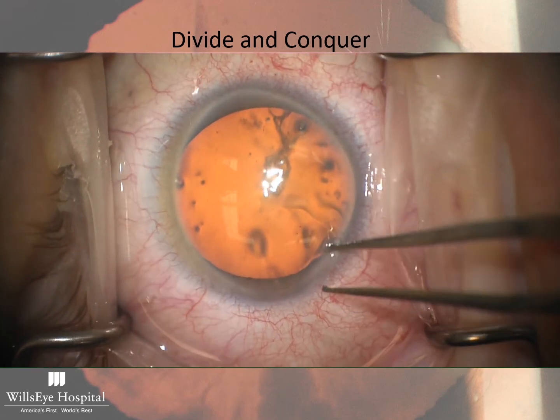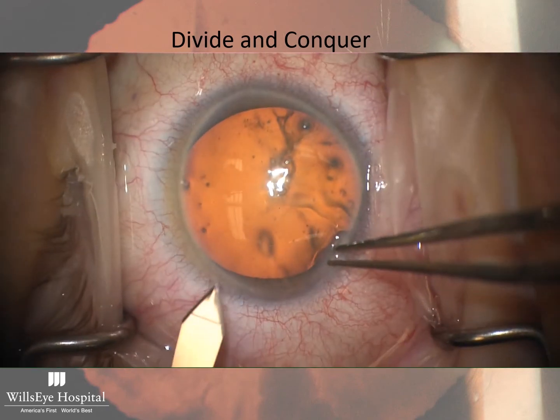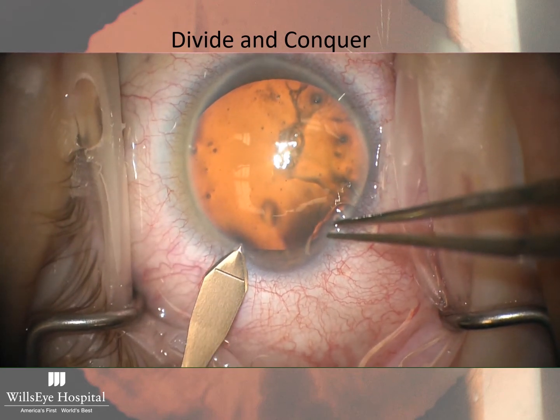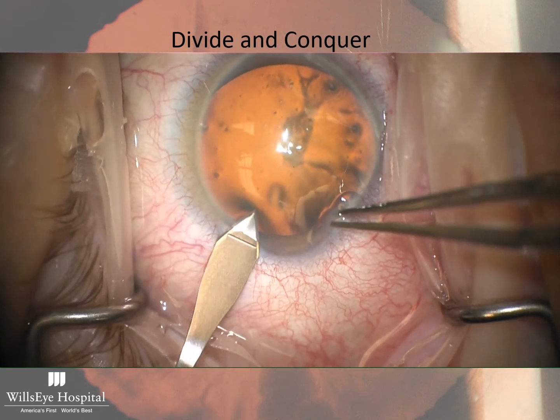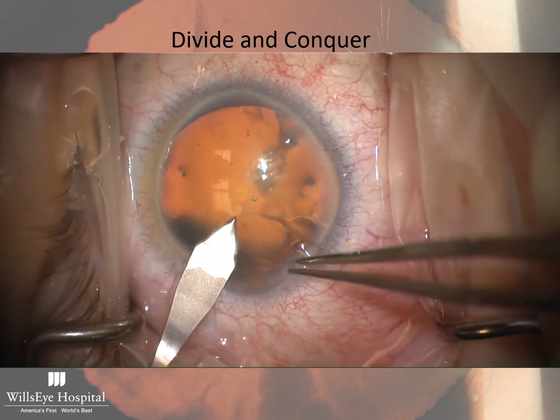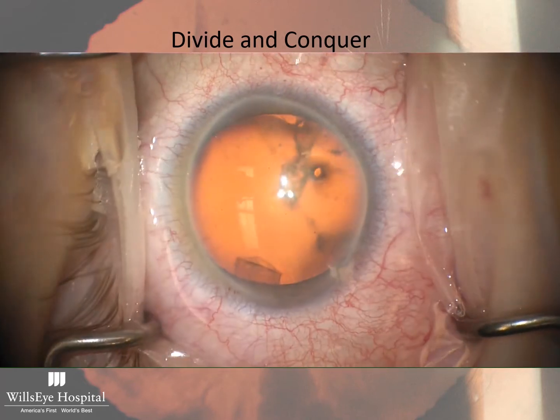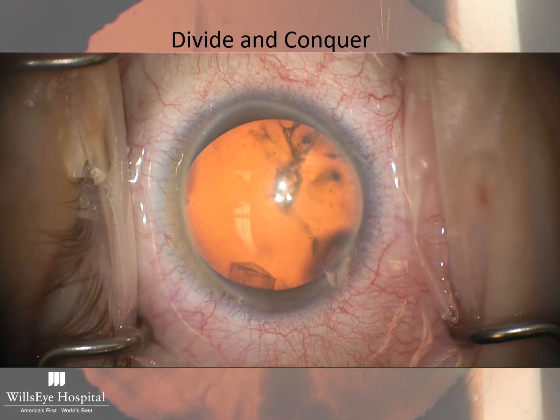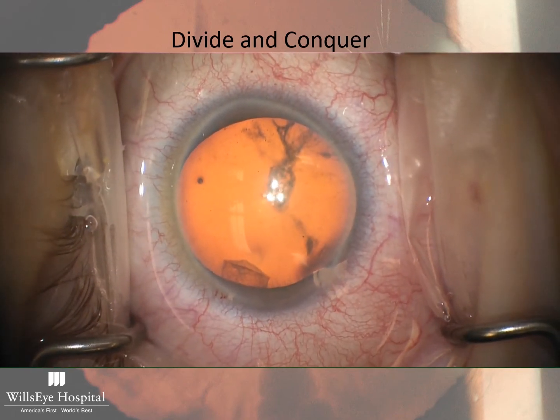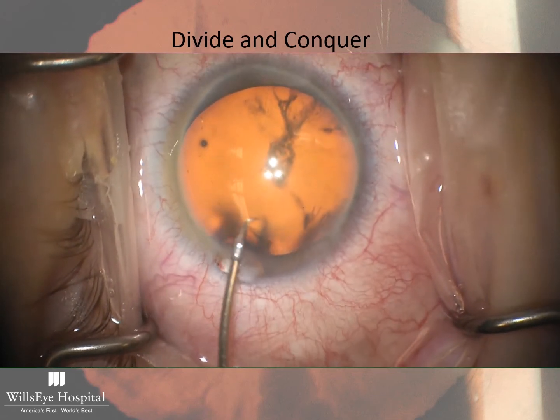I like to use 0.12 forceps to stabilize the eye. I put the side with one tooth in the wound, the side with two teeth outside of the wound. I'm using a 2.4 millimeter keratome. This is a biplanar style incision, traveling up into the cornea and then down through Descemet's. I currently create a triplanar wound and create an external groove at the limbus to facilitate accurate starting placement and intact epithelium at the edge of the wound.